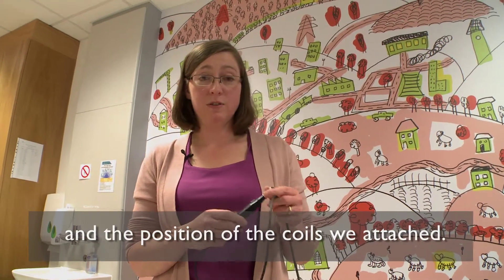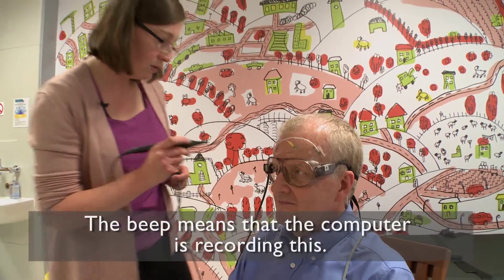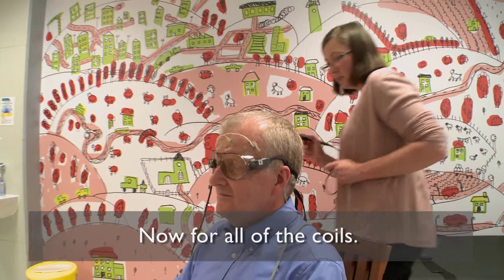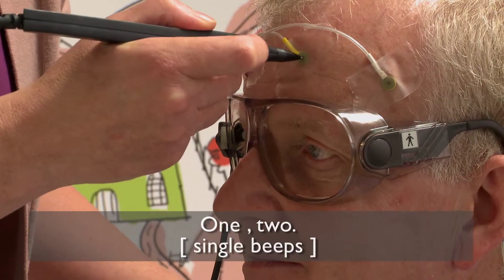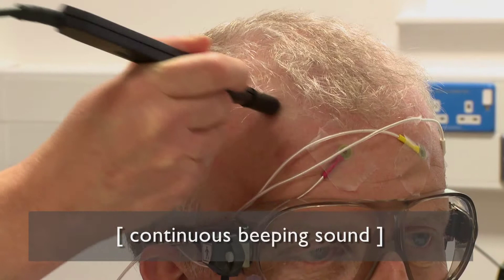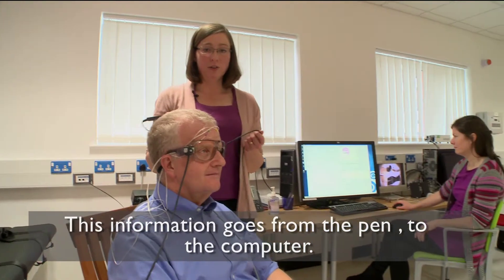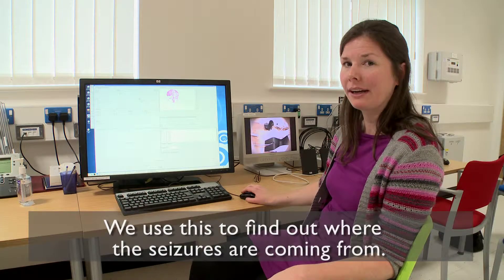First of all, I'm going to measure the position of Stefano's nose — the bridge of his nose. The beep means that the computer is recording it. And then his ears, one and two. Now I'm going to do the same for all his coils. We've now finished the process of measuring the shape of Stefano's head. That information goes from this pen to the computer, and we use this to find out whereabouts in the brain the seizures are coming from.